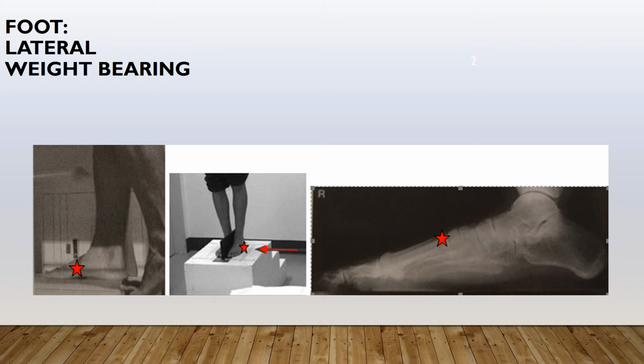And the best way to do this is to bring the foot that needs to be x-rayed against the cassette, so it's 100% lateral, and then have the patient stand normal with the other foot. When they're doing that, they're either going to supinate or pronate, and the podiatrists like to see that so that they can get their biomechanical angles off of their image.